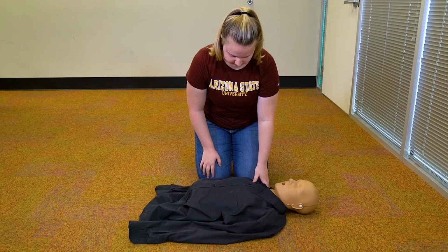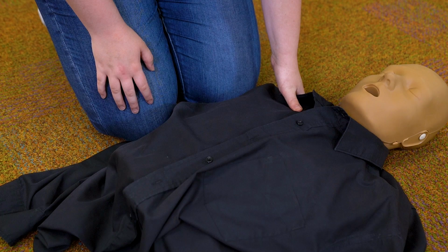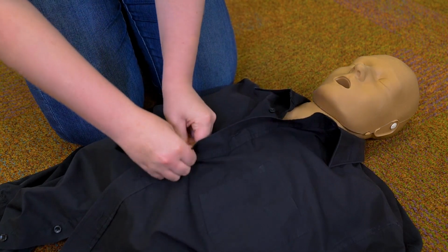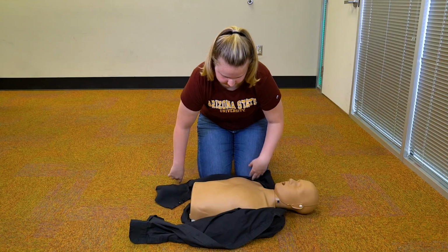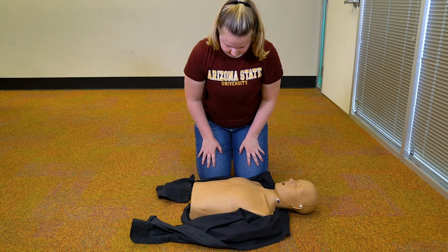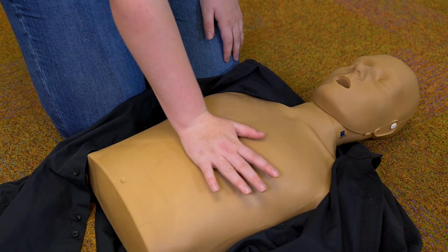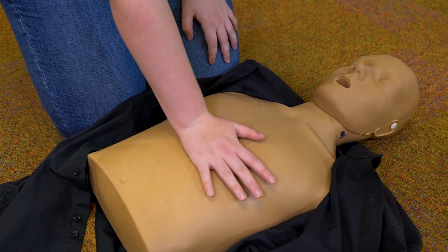First, position the victim on their back on a firm surface. Next, unbutton or remove the victim's shirt to expose their bare chest before beginning chest compressions. While kneeling beside the victim's shoulders, place the lower palm of your hand over the center of the person's bare chest where the sternum meets the ribs.